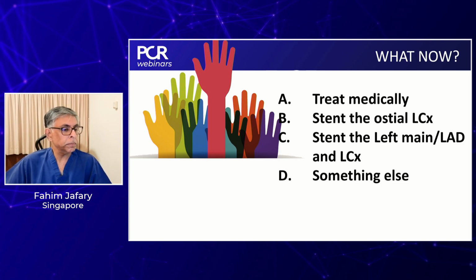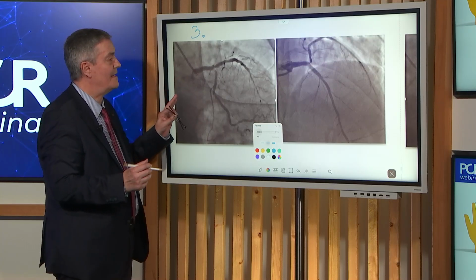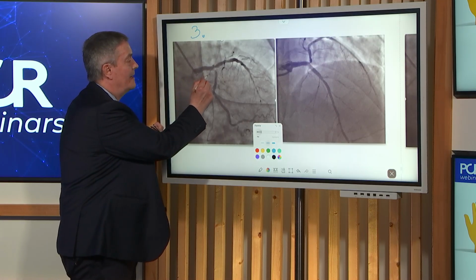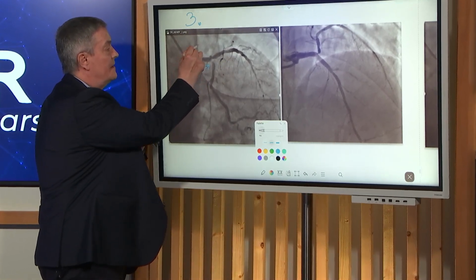Yeah, thank you very much, Fahim. I try to reflect on your case here, just showing clearly very tight disease at the ostium of the circ.